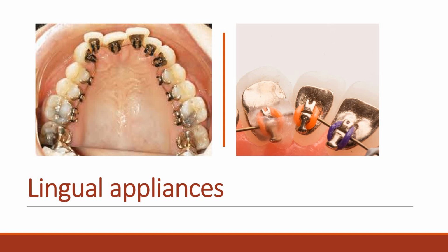The principal advantages of lingual appliances are the improved aesthetics, lack of labial decalcification in cases with poor diet or plaque control, and better bite opening due to a bite plane effect of the brackets. Disadvantages for the patients include problems with speech, soreness of the tongue, and increased cost. Whilst for the orthodontist, there is the inherent difficulty and time required for chairside adjustment.